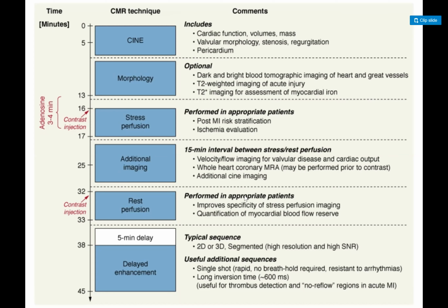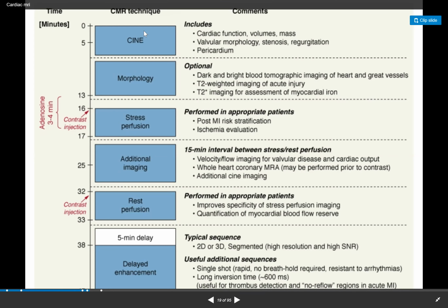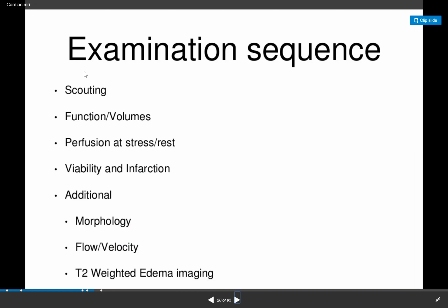I was talking about this sequence. Most of the times I put this up there, although we do not do this stress sequence. What our imaging is that first we do a scout sequence, and then we do something called functional volume assessment with Fiesta SSFP imaging, and then we give contrast and image after the contrast.